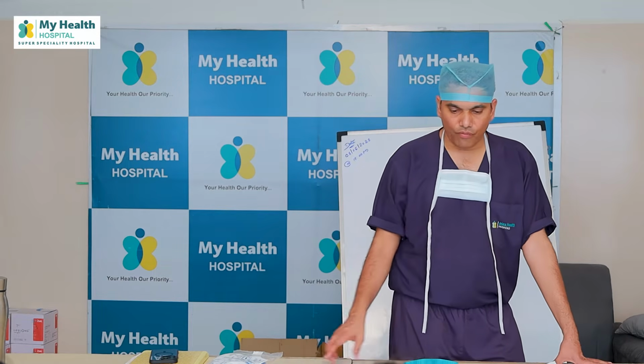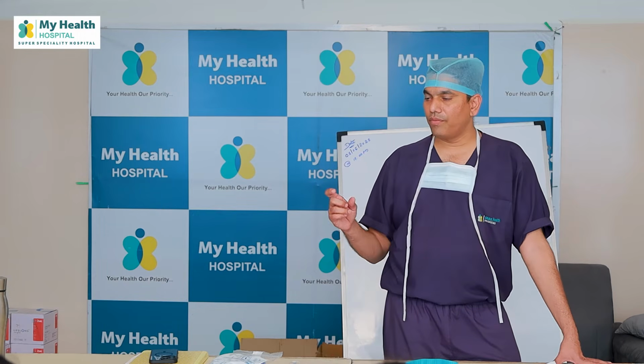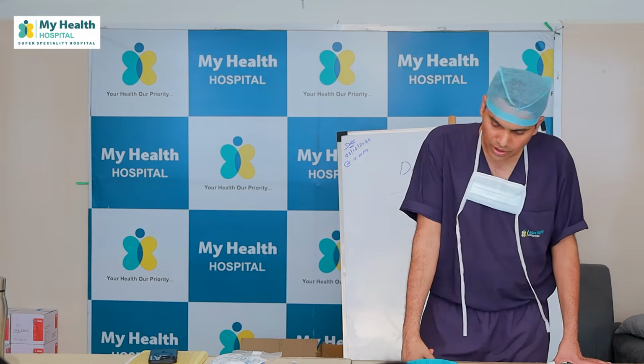What is the pressure that should be given when inflating? And what is the ideal liquid that we are supposed to push in? Sterile water, distilled water. Why not NS?